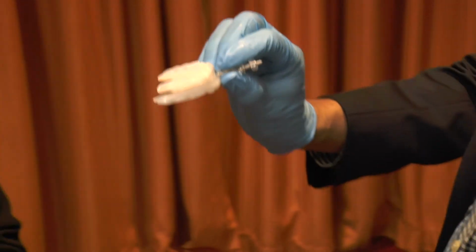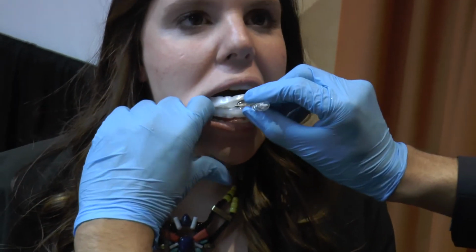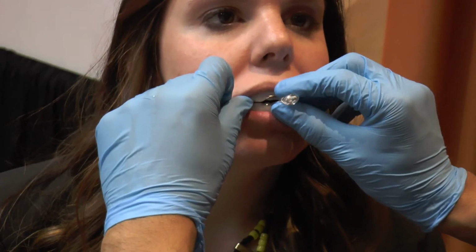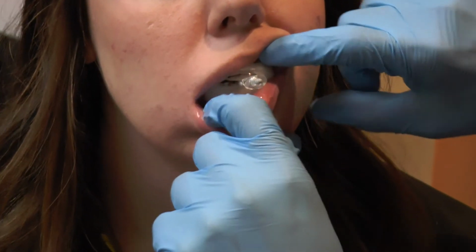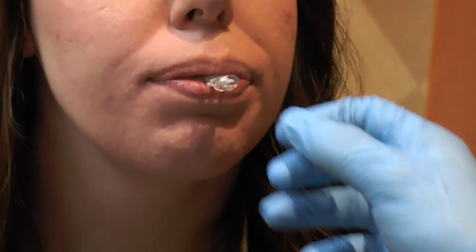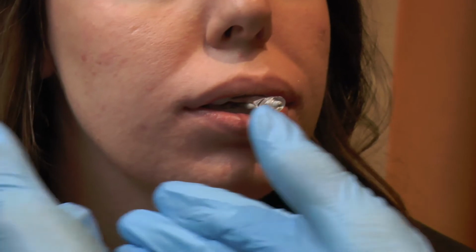So we're going to go ahead and collectively re-engage this device into Tricia's mouth. All right, go ahead and close down into that and bite down into it. So what you can get a sense of is with the two components together, you've got your point of reference where the lower tray, upper tray meets, where it doesn't seem to pull the jaw in one direction or the other.